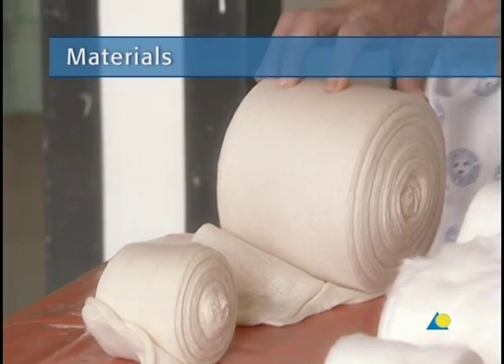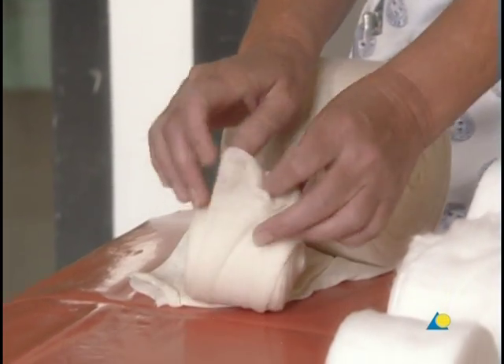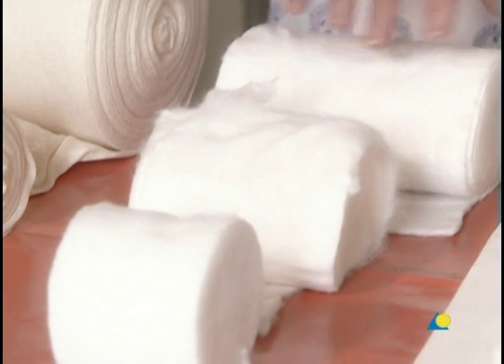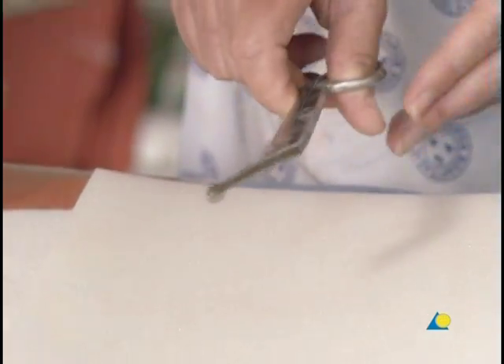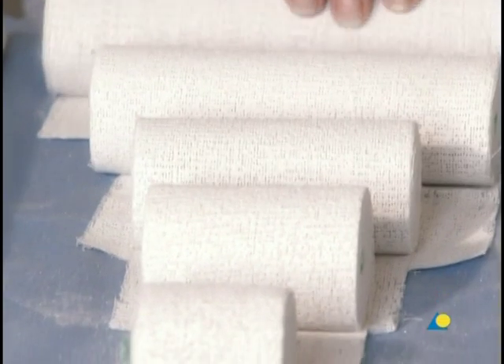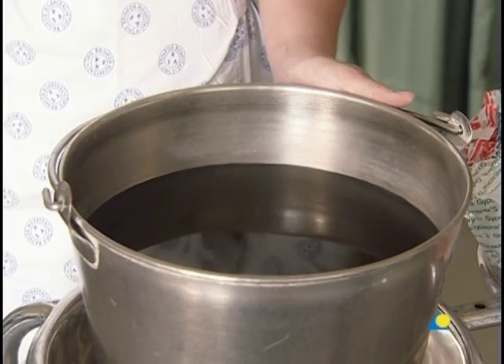To apply the thumb spica, the following materials are needed: a stockinette or tubular gauze bandage; cotton wool, which will be used as undercast padding; scissors; plaster of Paris bandage, available in rolls of varying widths; and water or another wetting agent.